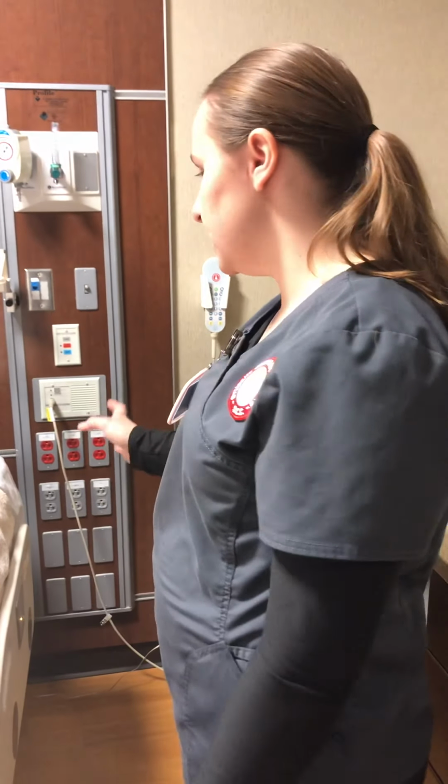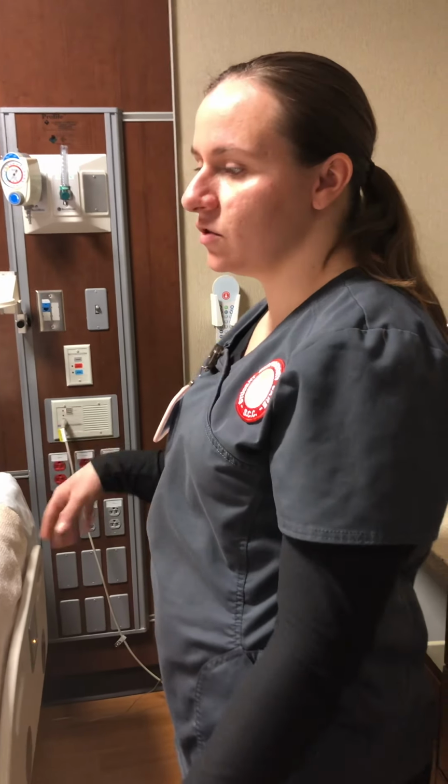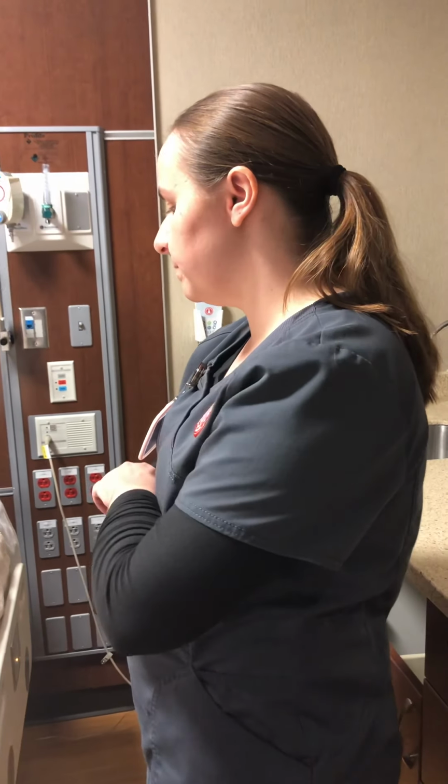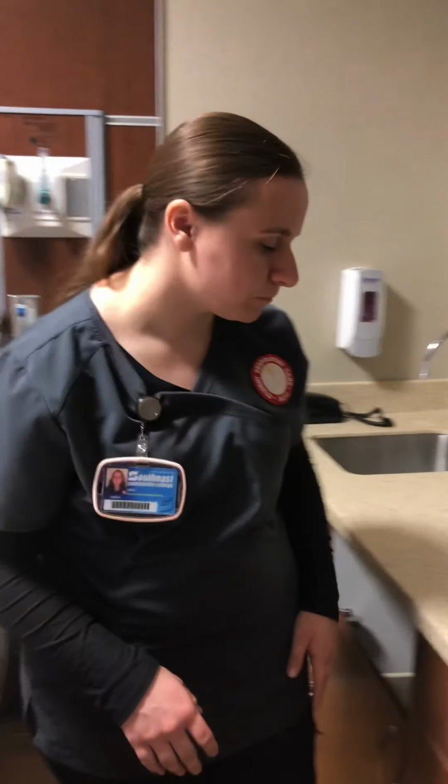And then I will set the patient up to where they're comfortable sitting upright. So if they're laying down, I'm going to instruct them that I'm going to move their bed up and move them up. And then I will put either a bedside table, that way they can rest their elbows on something when they do the breathing treatment with the acapella.